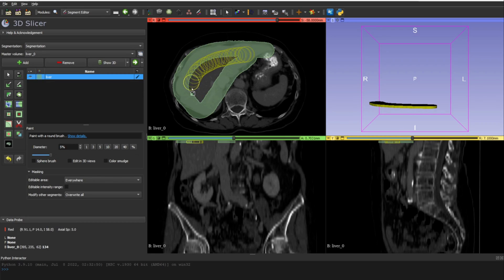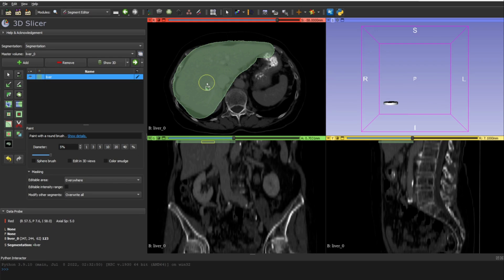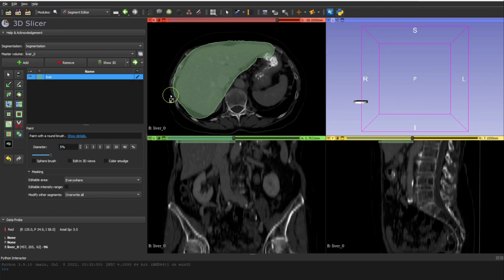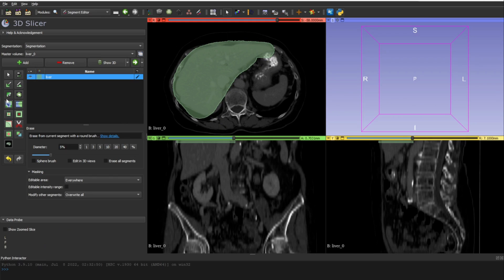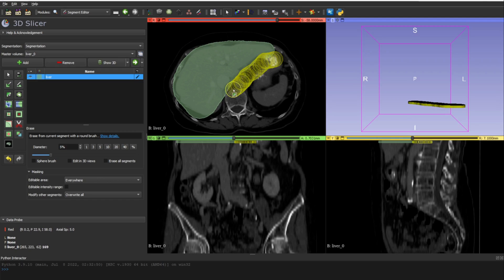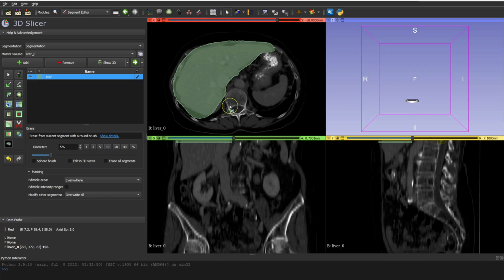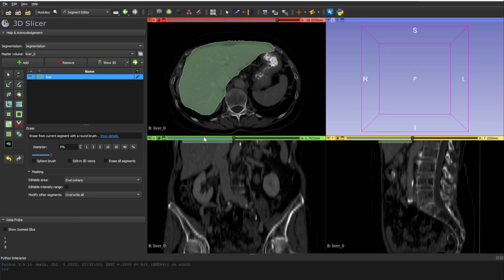As you may have seen in my ITK-SNAP video, I prefer to annotate broadly first and then use the eraser to refine borders — it's faster and easier. Now let's select the eraser tool. You can come here and start cleaning the borders. Unlike ITK-SNAP where you right-click to erase, in Slicer you need to explicitly select the eraser tool.